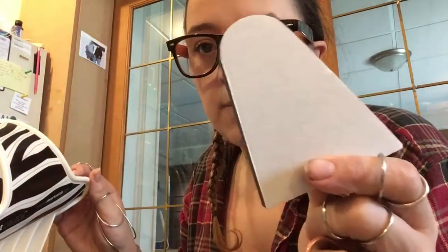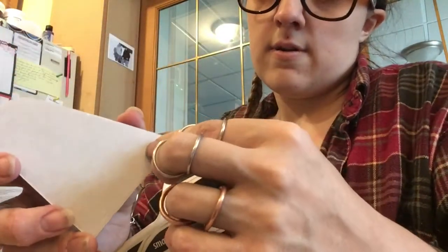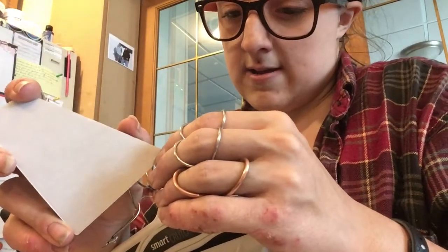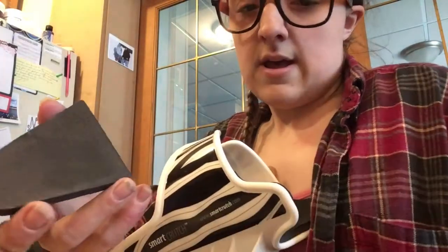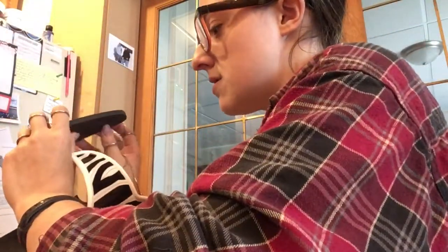It's just the foam pad with the adhesive, and then the directions just ask you to line up the proper pad, because they're obviously directional since this goes on the other side as well. So line up the pad, make sure it looks right with how you want it with the foam, and they're permanent, so don't mess it up. And then you just need to remove the adhesive, if I can. Oh my gosh, here we go. Okay, so then the adhesive comes off, and then once you stick this, it's permanent, so don't mess it up. And then you need to stick it right on.